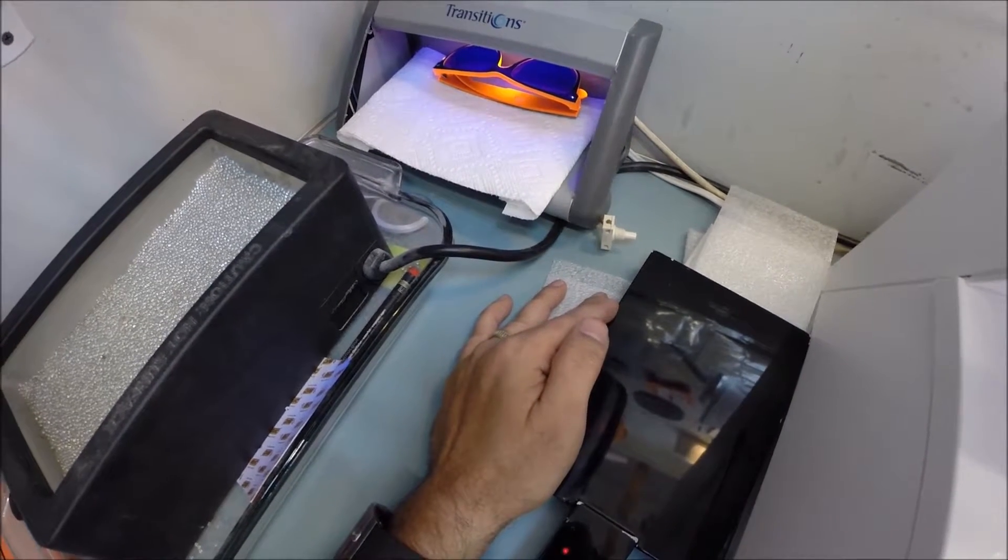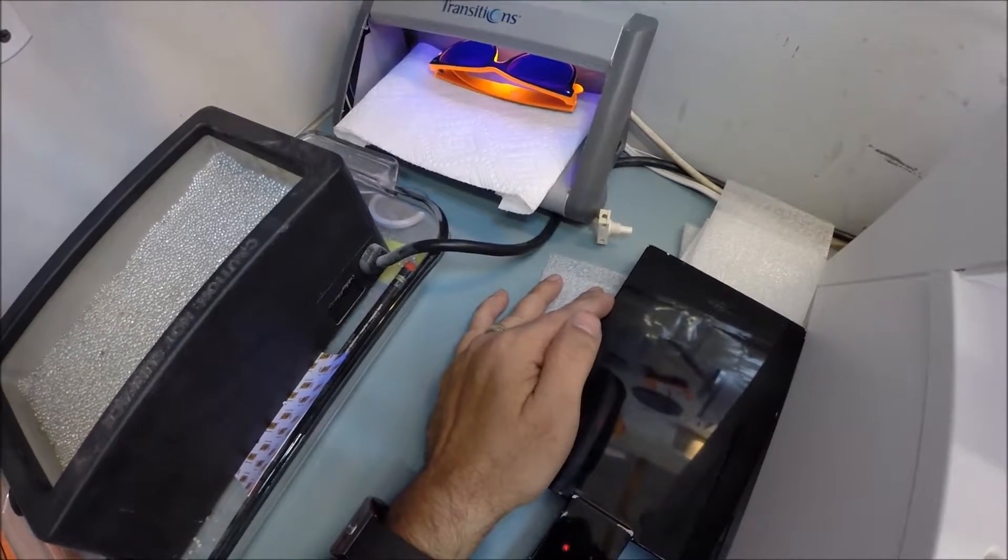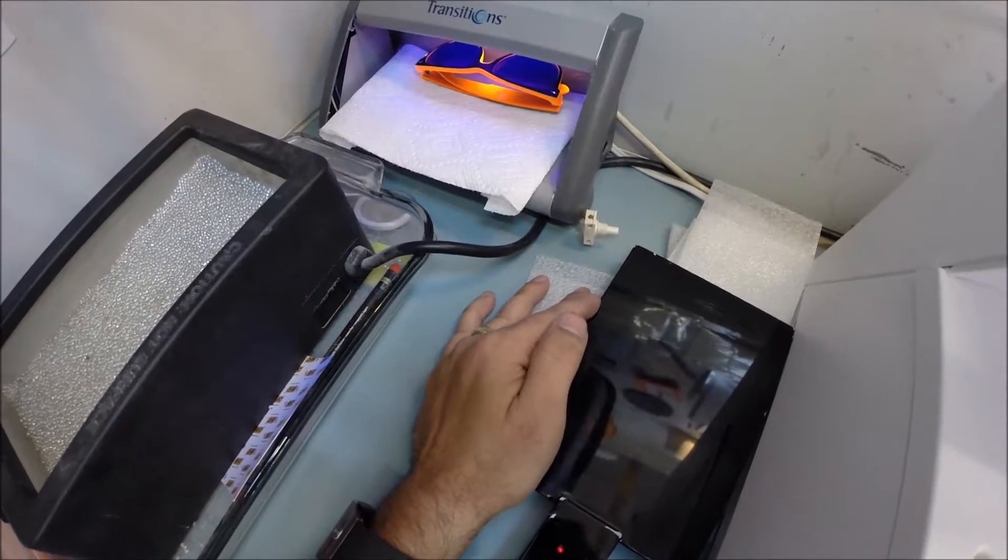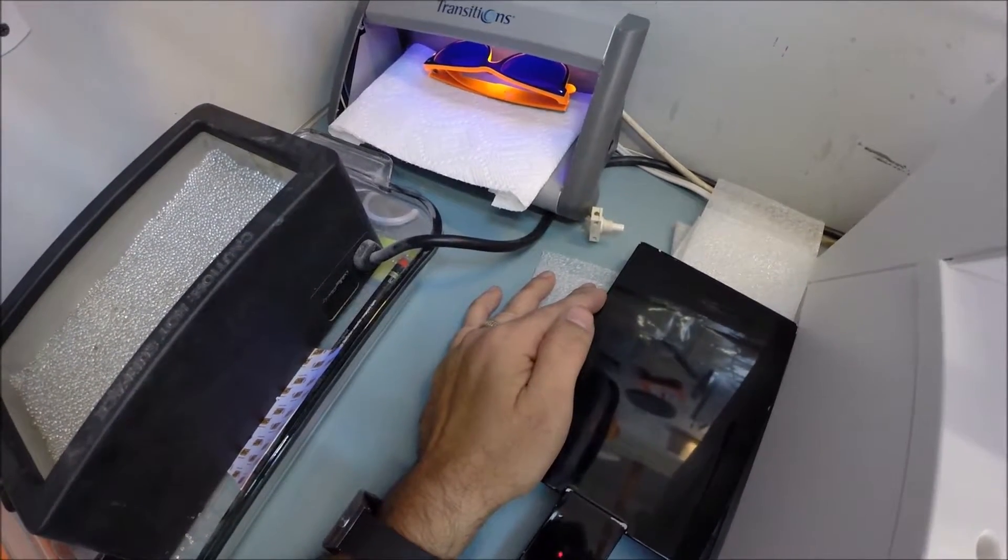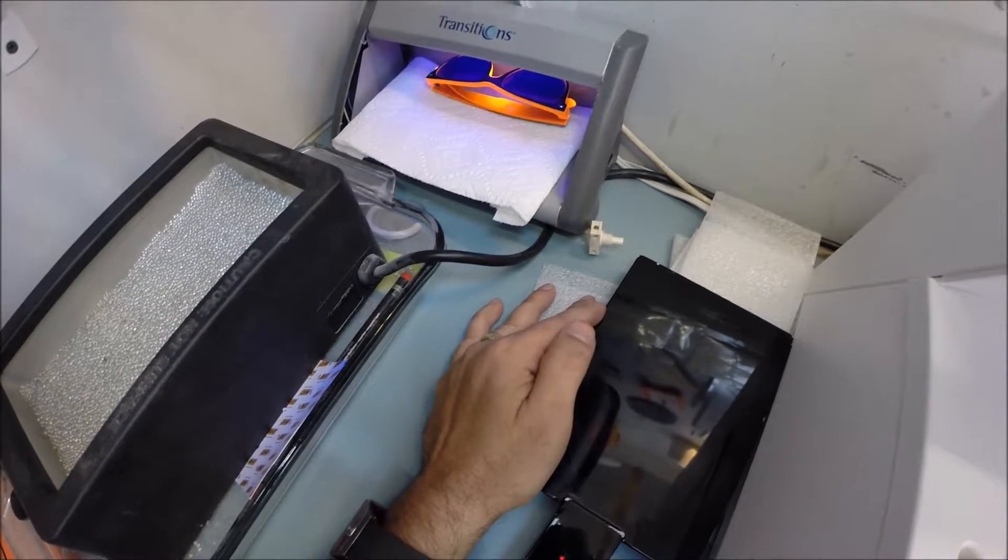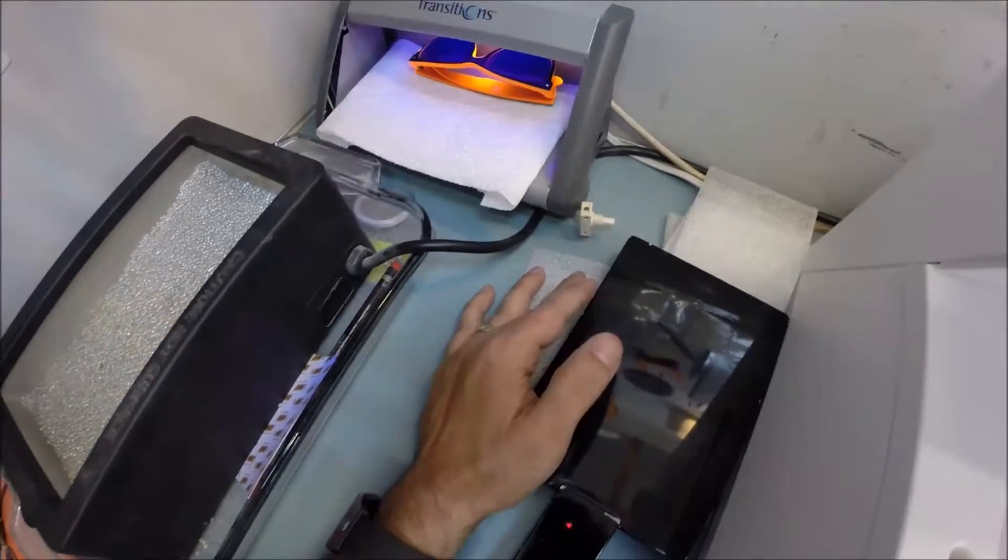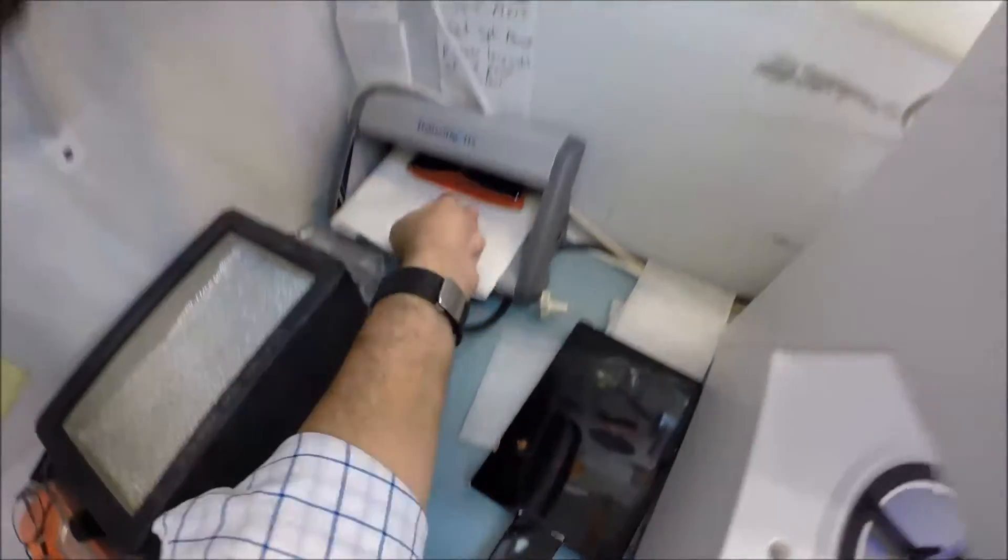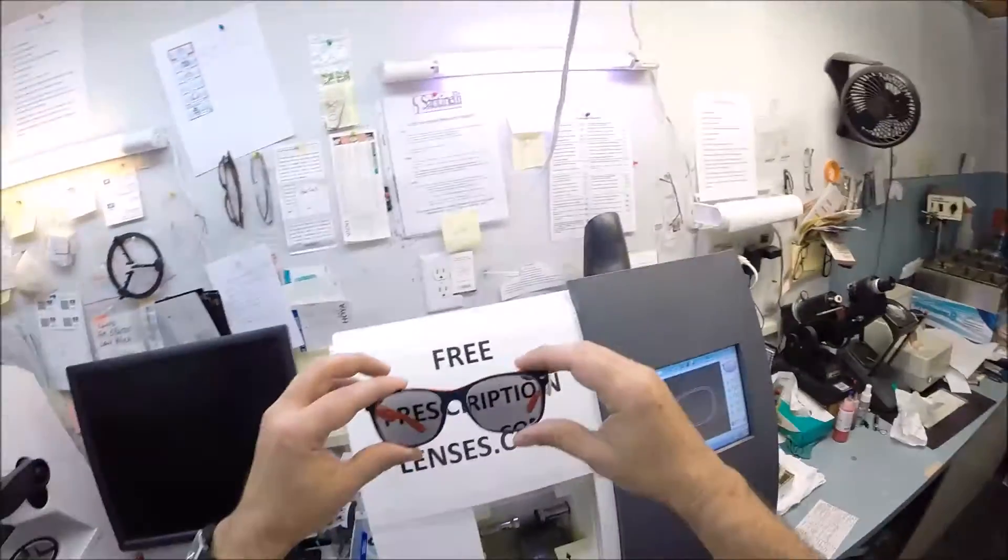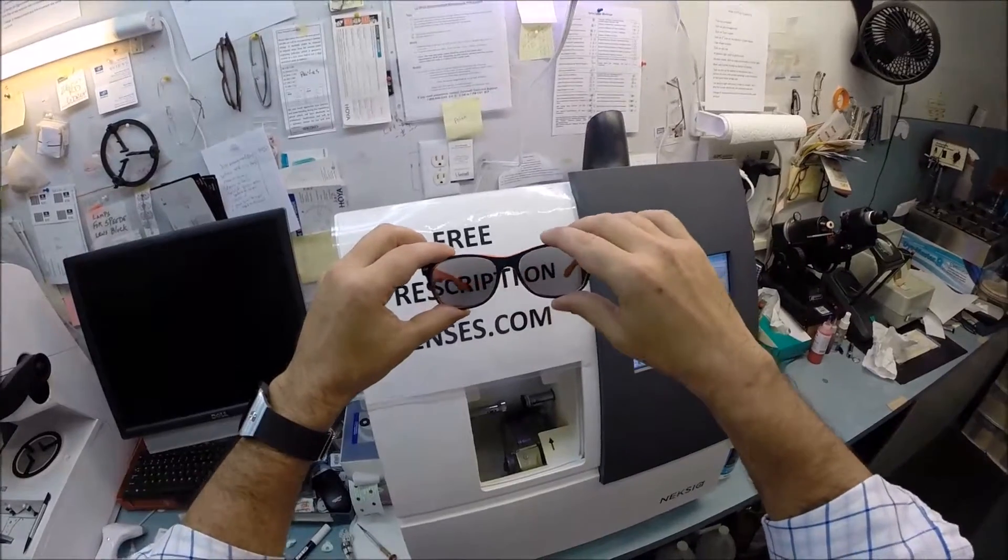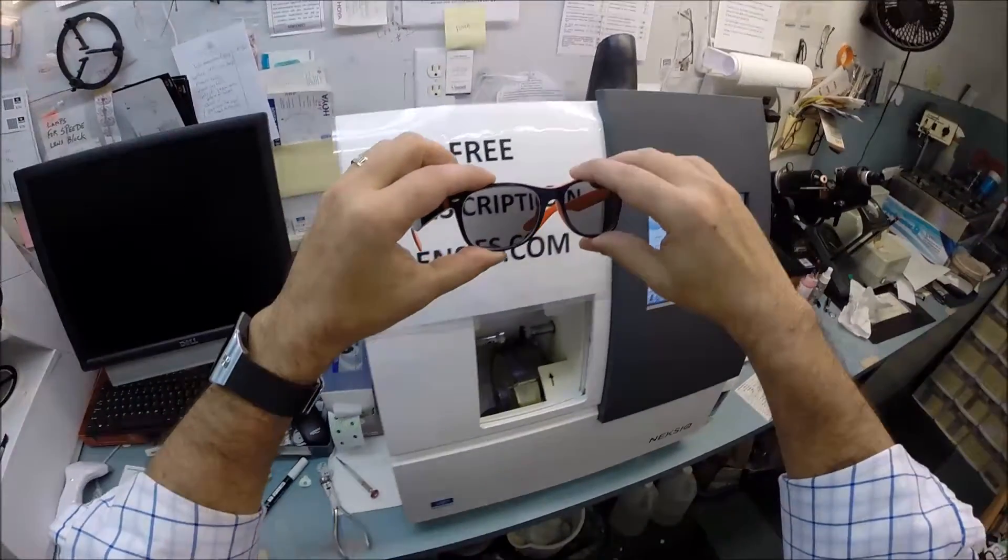Your windshield absorbs all the sun's harmful ultraviolet rays so your dashboard doesn't crack from sitting in the sun. Plus, your lenses are temperature sensitive. They will get darker when it's below 85 degrees than when it's much above 85. When it's 100 degrees outside, you're miserable, they're miserable. Nothing likes to work 100% when it's 100 degrees outside. That is the first time of me activating your lenses. They will continue to darken every day for the first two weeks as I explained.